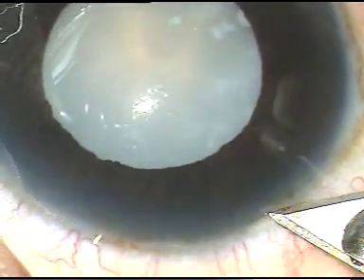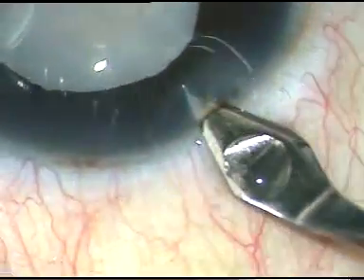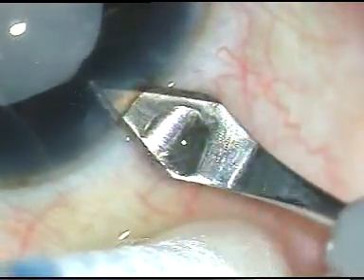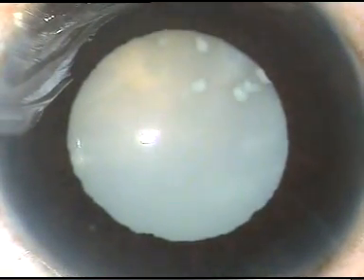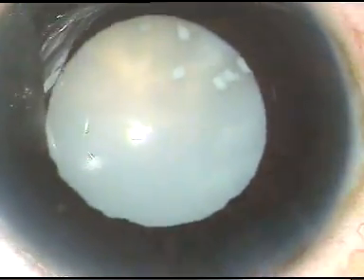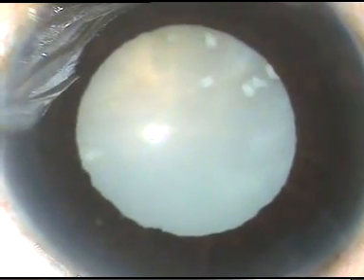Friends, this is a hypermature cataract. This is the main incision with a 2.8 mm keratome. And now, one side port is made on the right side of the main incision.